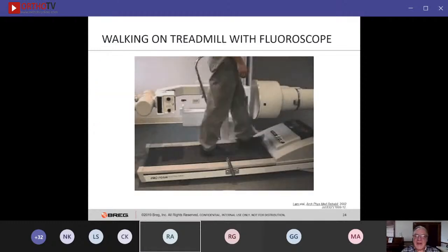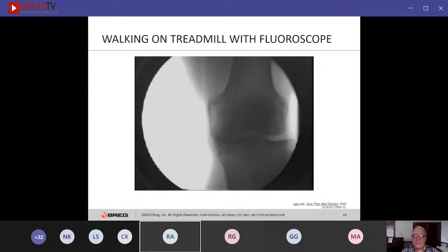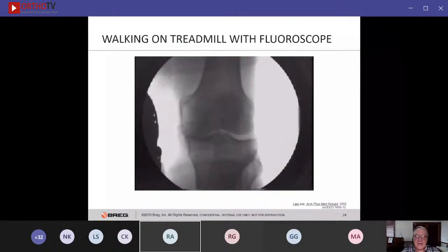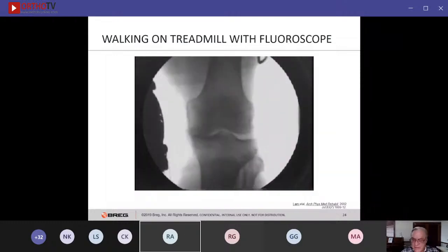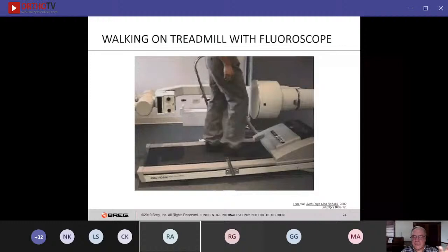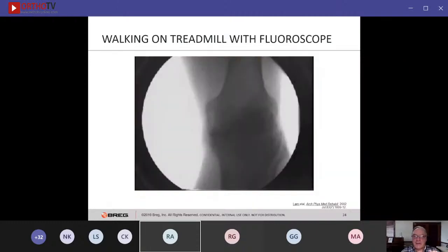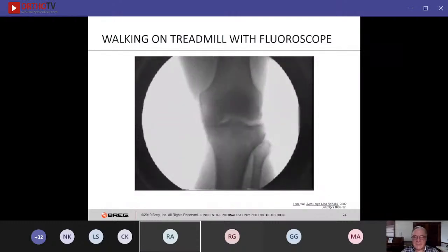So here's a patient. They can vary the pace until they get to a pace that is comfortable for them, walking without the brace and then walking with the brace. And they continue doing this, and the data is all captured by the computer. Now, the computer is also taking pictures at specific points in the video. The two biggest peaks are heel strike and mid stance.